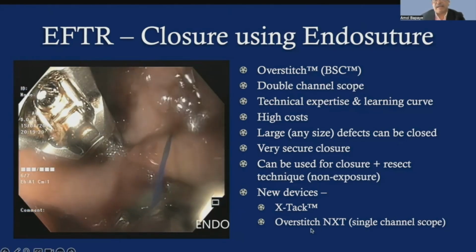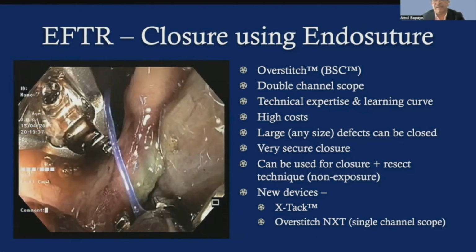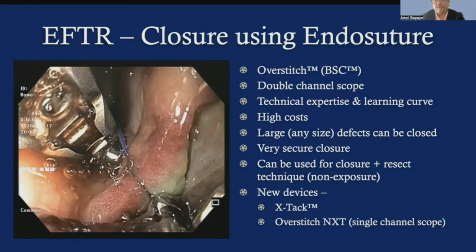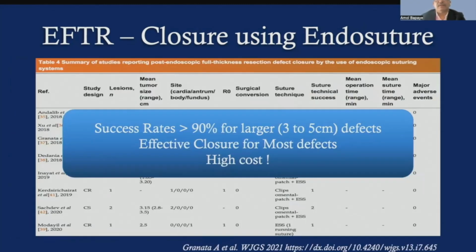Now with the X-Tack and the OverStitch NXT, the newer generation devices, we can use them over a single channel scope as well, and that gives definitely good results. So apart from the cost, the closure with endoscopic suturing is probably the best, no doubt about that.